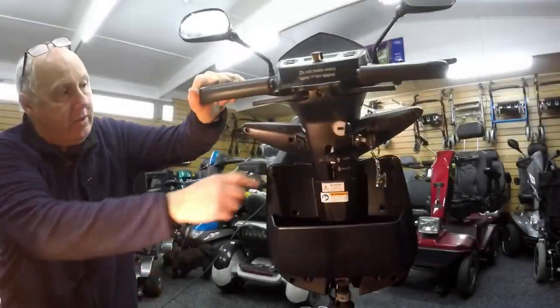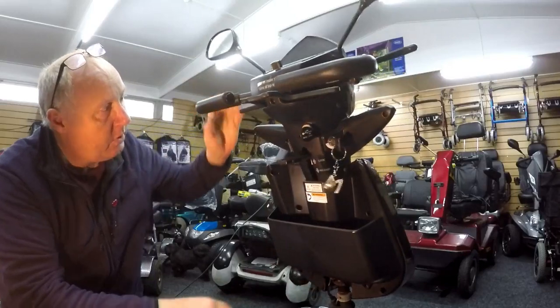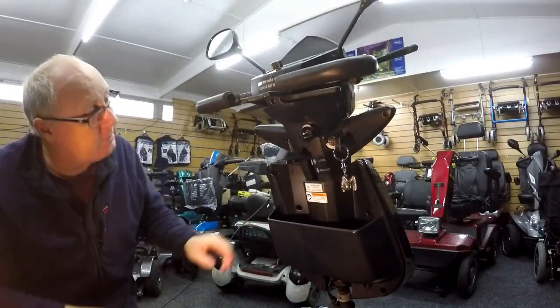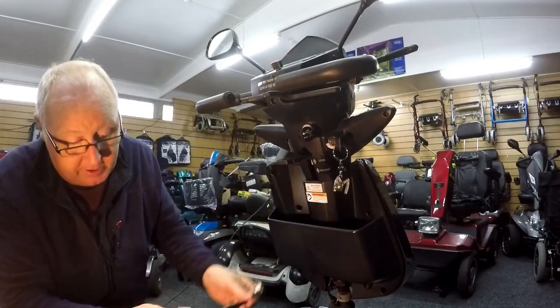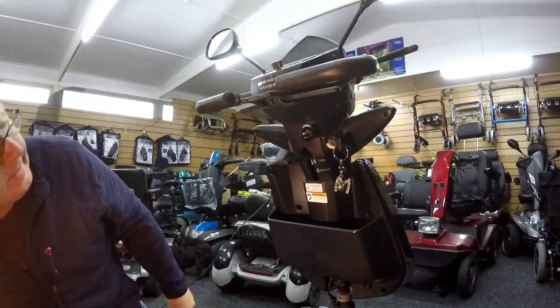So to gain access to this charging socket here, I'll need to remove all the plastics, because I need to put this in its place and then join up the wires. Let's have a wee look.